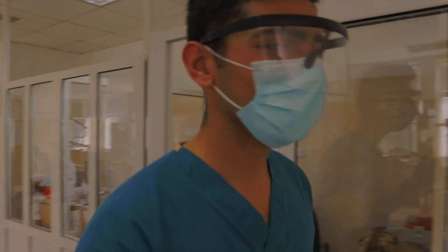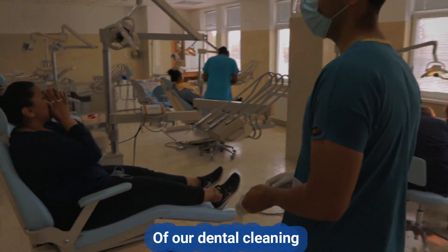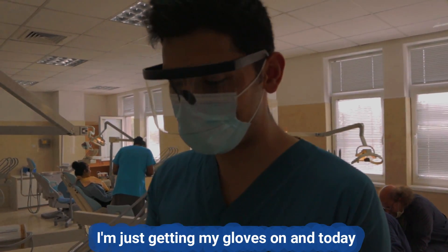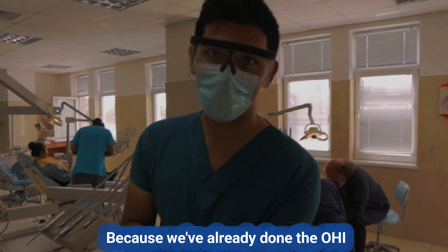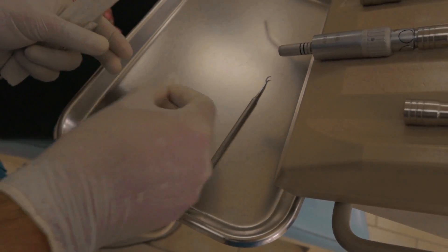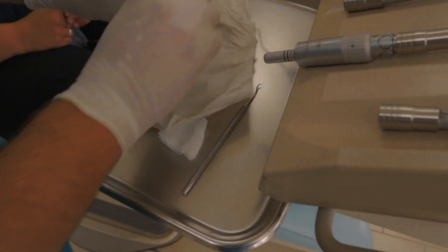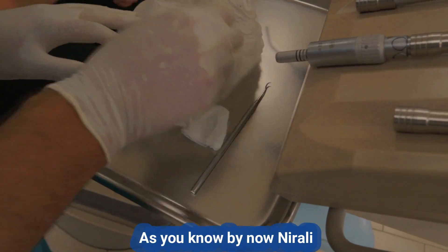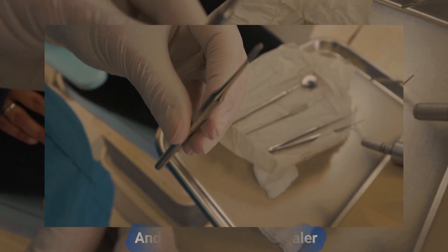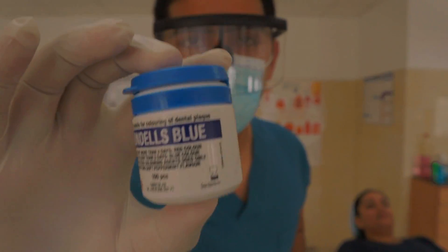So we're in our dental clinic. Welcome to part two of our dental cleaning. I'm with Nirali once again — thank you so much for coming in. I'm just getting my gloves on and today we are going to be doing the cleaning because we've already done the oral hygiene index. I collected my curette and sickle scaler and informed the patient on the procedure I was going to do today. I asked the patient to apply Vaseline on her lips to prevent the staining from Rondell's blue.